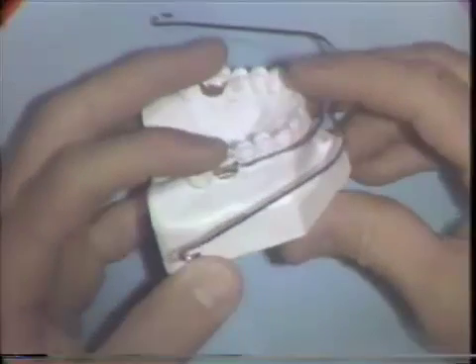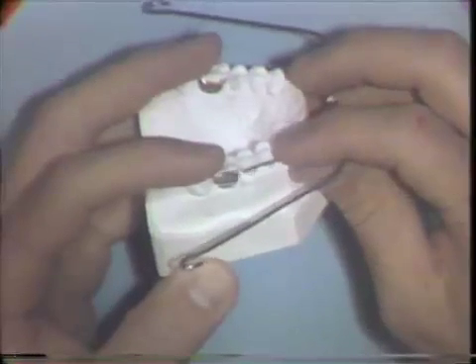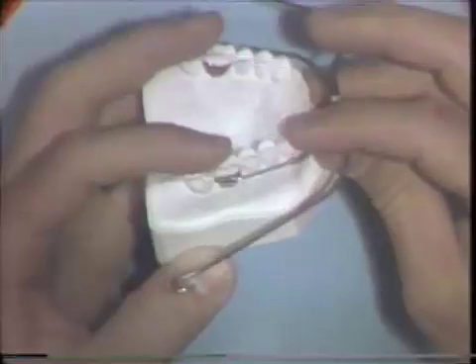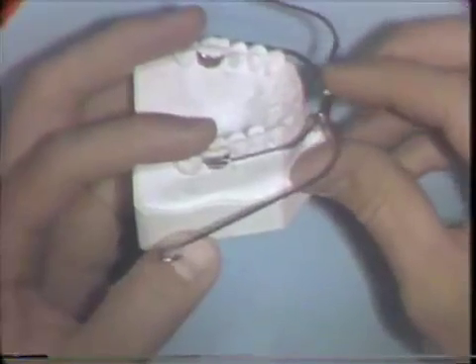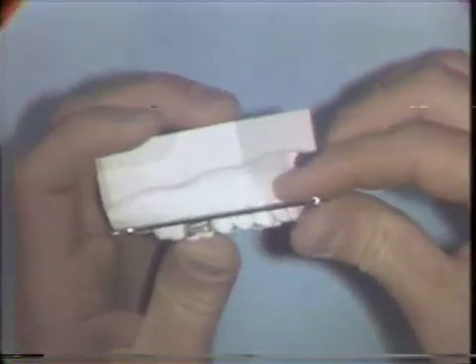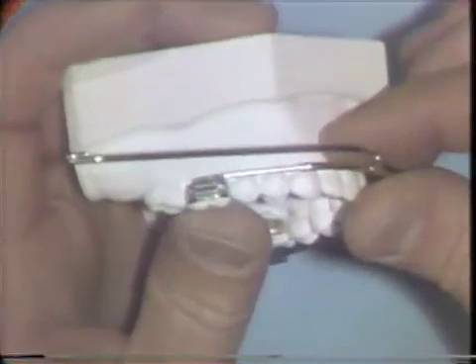You make bends at the bayonet bend area as needed to create a situation such that the wire rests passively directly over the top of the buccal tube on each side when it's engaged in the opposite side. We'll place it in this side and check the passiveness on the other side of the arch. There, the wire rests passively, just lingual to the buccal tube.